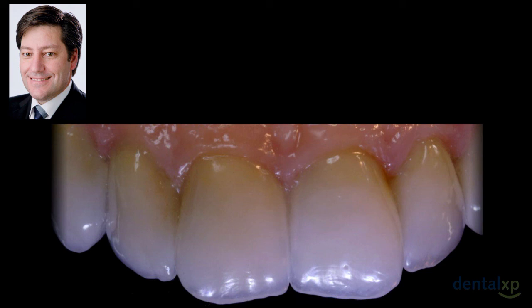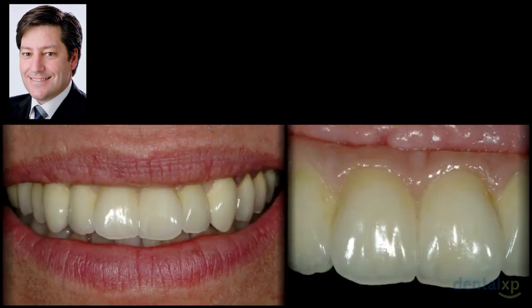Oftentimes I see this pink ceramic polished and flat, and this is probably one of the simplest things to address to improve the aesthetics: not making this flat and polished, because the soft tissues are not like that. And then your light reflection will be completely different. This is the case intraorally.